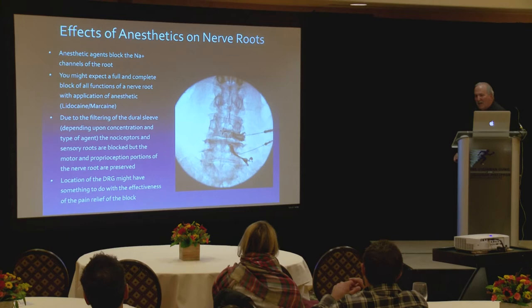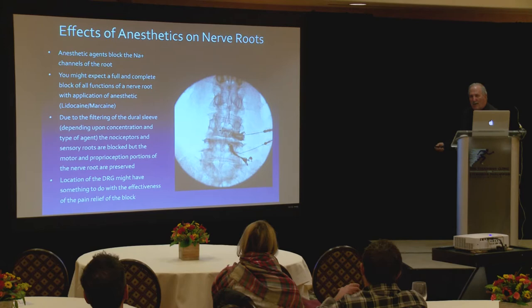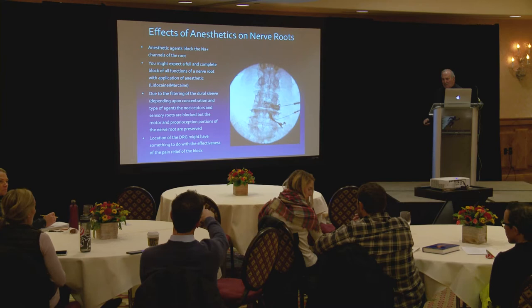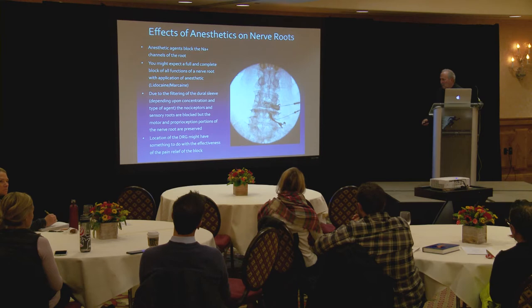Have you found doing an epidural versus doing a TFESI creates a change? Yeah, I mean, when you're asking me to be very specific and say, is this foramen, this nerve root, then I'm more lateral to the pedicle, and you don't get as much epidural uptake, so you're more trying to be that selective nerve. If I'm being a little bit more therapeutic, I might literally go a little bit deeper past the pedicle shadow more centrally, and that will get more broader epidural spread and great. More therapeutic there. So less diagnostic for you. Patient feels better.